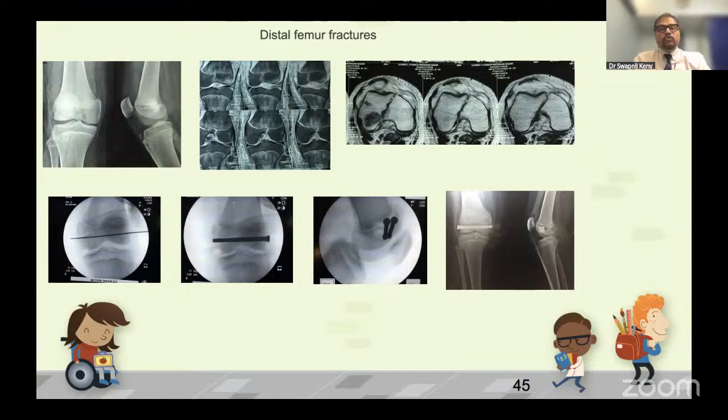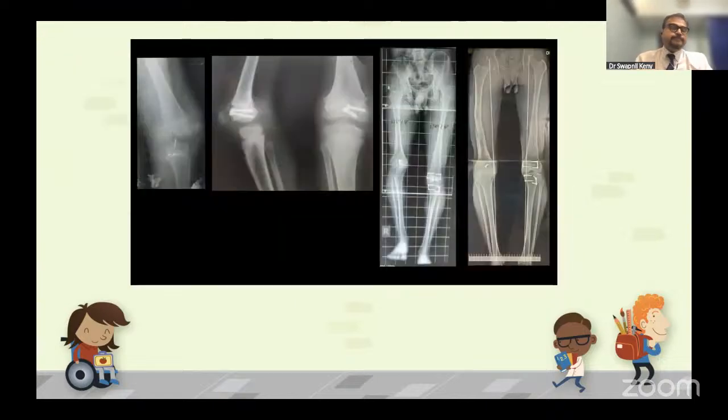So if you look at this particular fracture, you need to pass your screws in a particular manner, especially when going laterally. You have to go lateral anterior to slight medial posterior so that you can get your lag effect across the fracture site. So this particular case, again a type 3 Salter Harris injury, reduced completely and fixed with cannulated cancellous screws only, went on to give a good result.